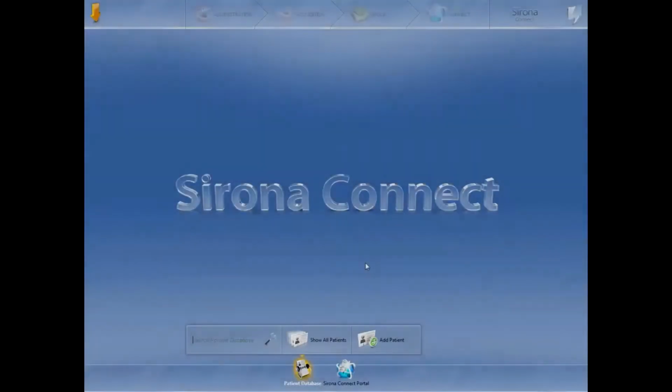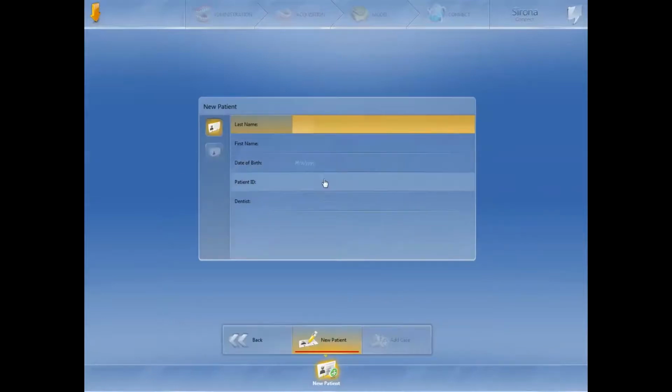What we're going to do today is use the CEREC Omnicam to take the scans necessary for MIS's MCenter to prepare a custom zirconia abutment using a titanium base. Other labs are likely to require a similar scanning process. We'd start by adding a patient.